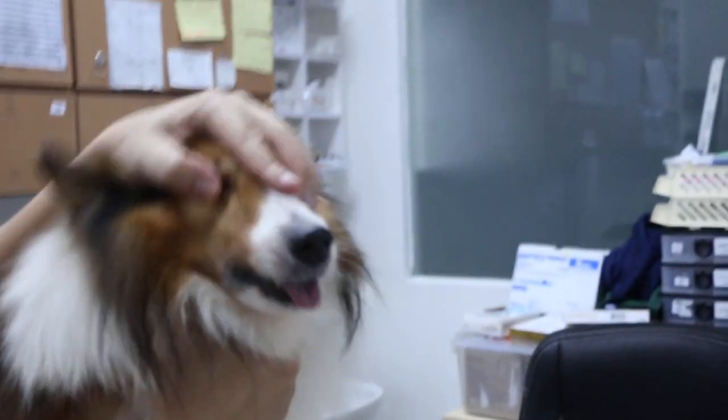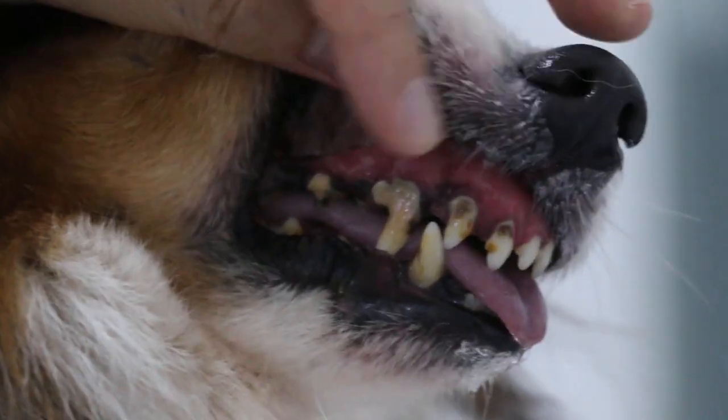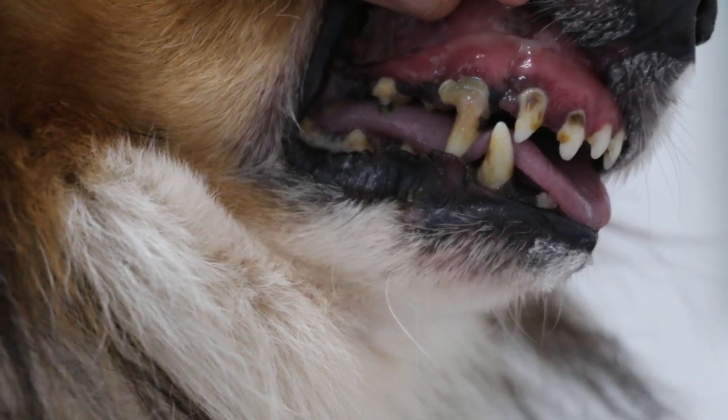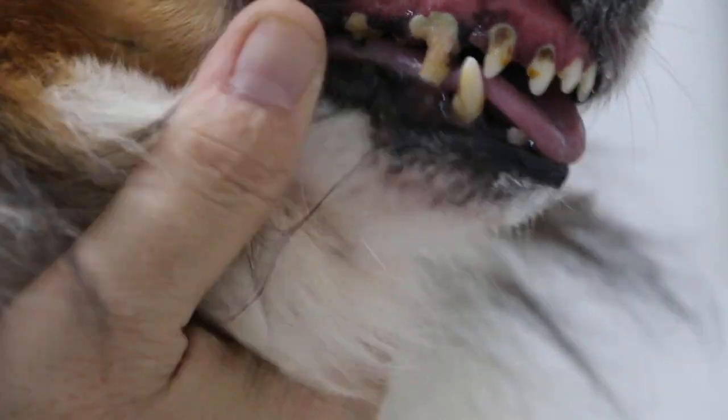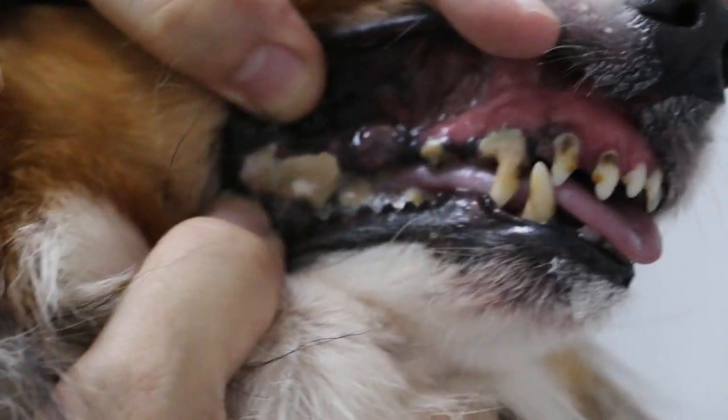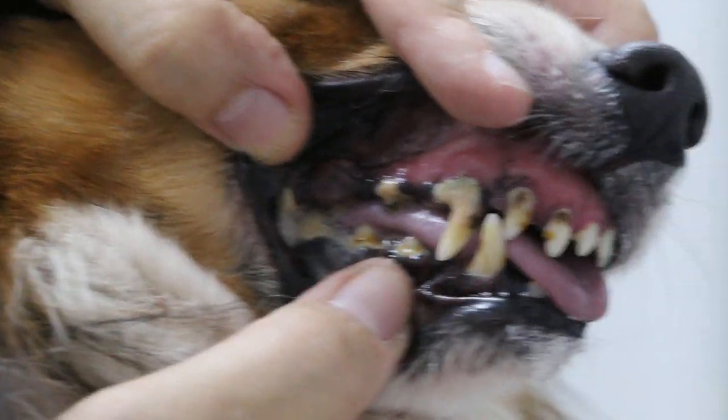What is premolar 4 on the left side? On the right side, I will examine the dog. Now he's a bit nervous. You can see the canine tooth, all exposed gums, with tissue attachment loss. So this is grade 4 periodontitis. The tartar is also thick here. For 7 years, there was no dental scaling.